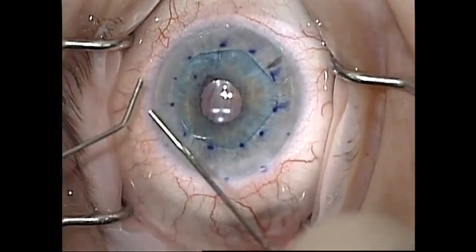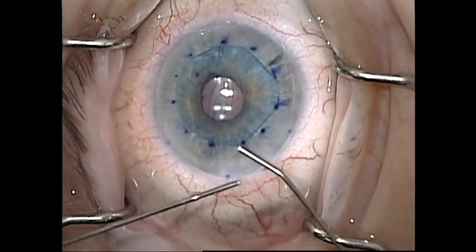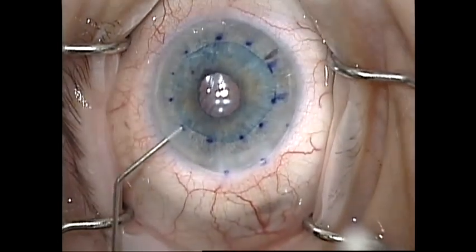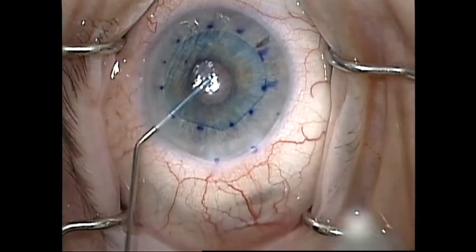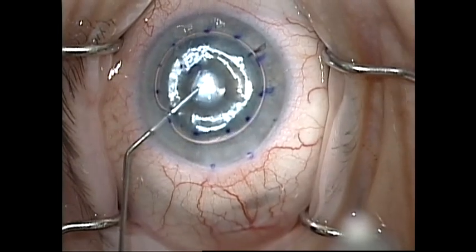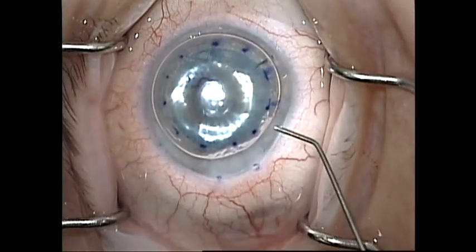I then pay attention to fine centration techniques as I have detailed in other videos. Once I'm satisfied with the centration of the graft, I'll lock it in place with a 20% SF6 gas bubble. When injecting the gas bubble, it is important to maintain the eye in primary position and to have the cannula positioned as central as possible. Failure to do so can result in decentration of the graft.